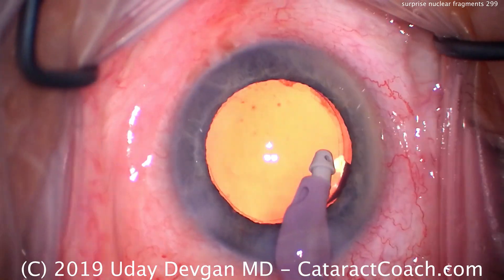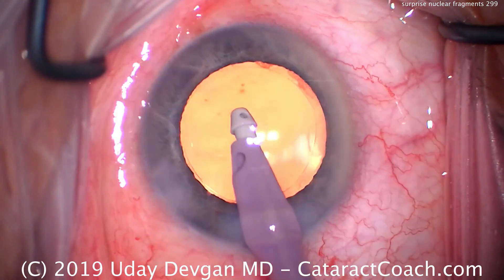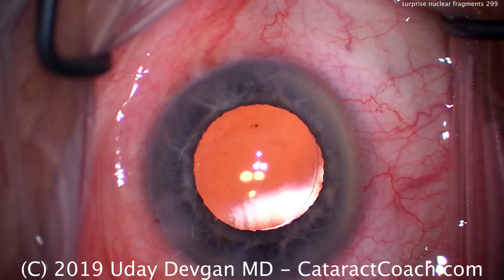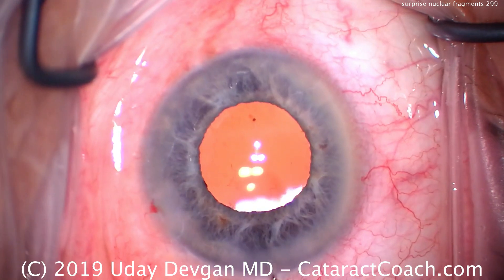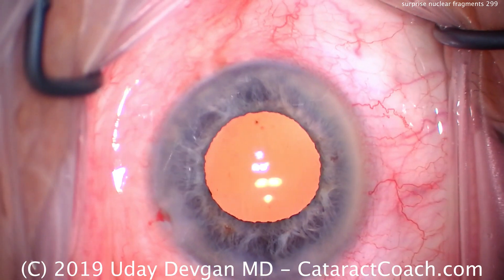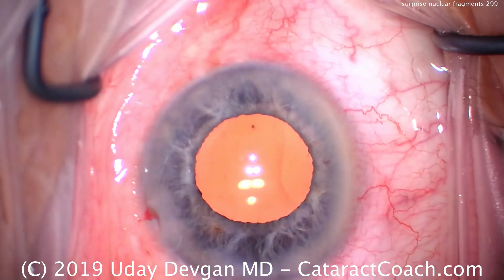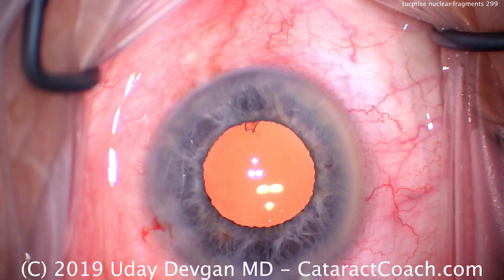Think about it: 60 cc's a minute. If the volume of the anterior chamber alone is, let's say, a quarter of a cc, that's about turning it over 240 times a minute. So if we have just 15 seconds of IA at the end, that'll turn over the entire contents of the anterior chamber many, many times — about 60 times.